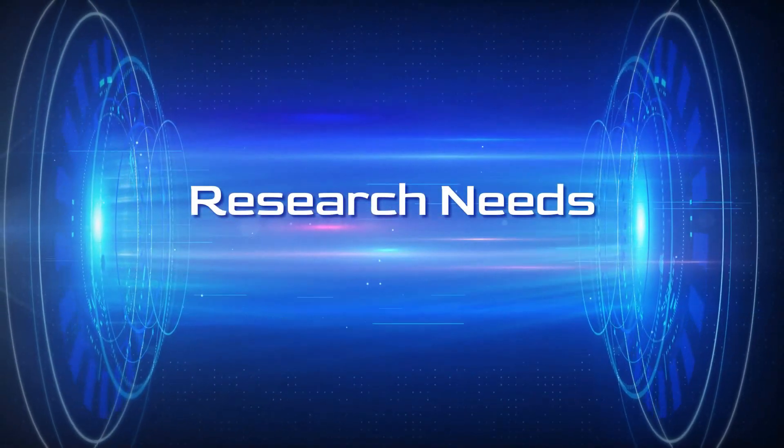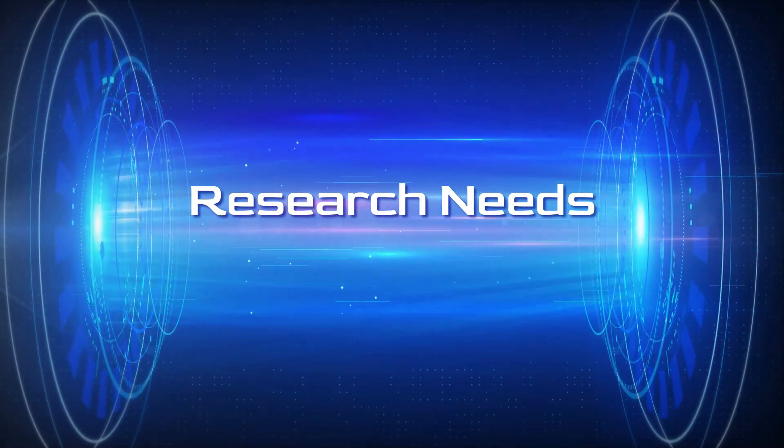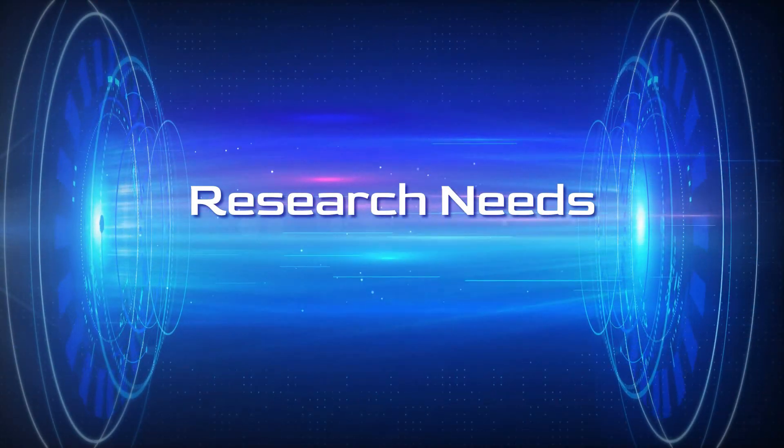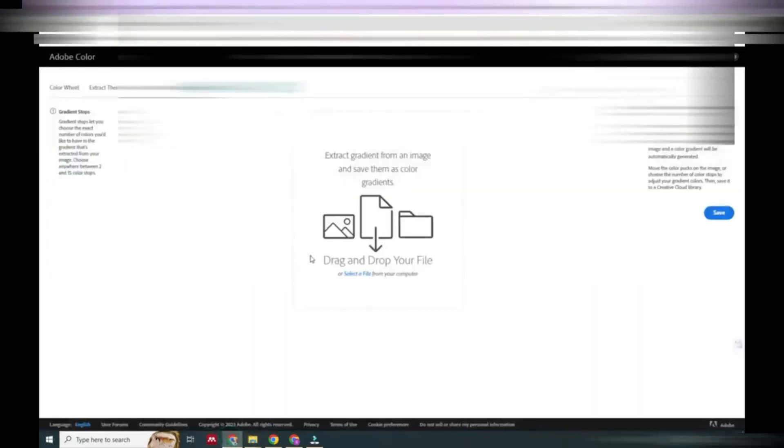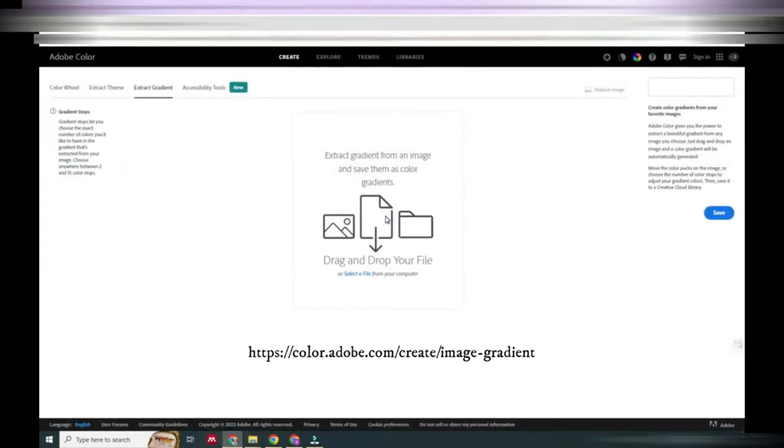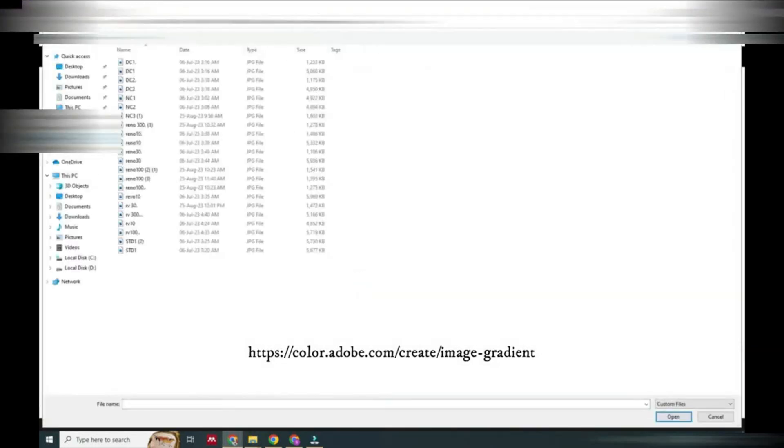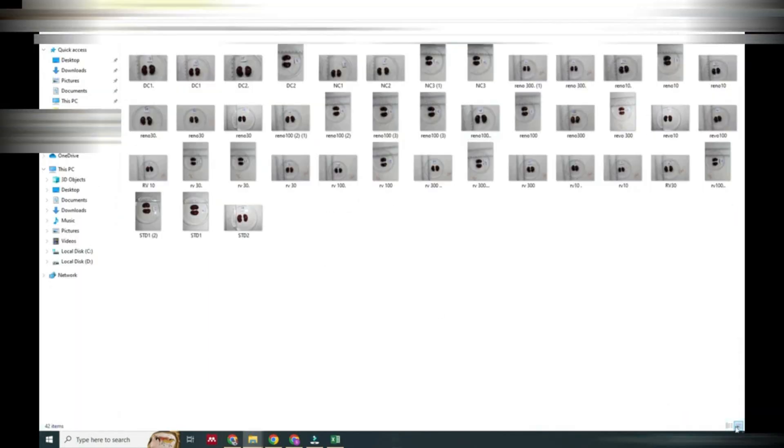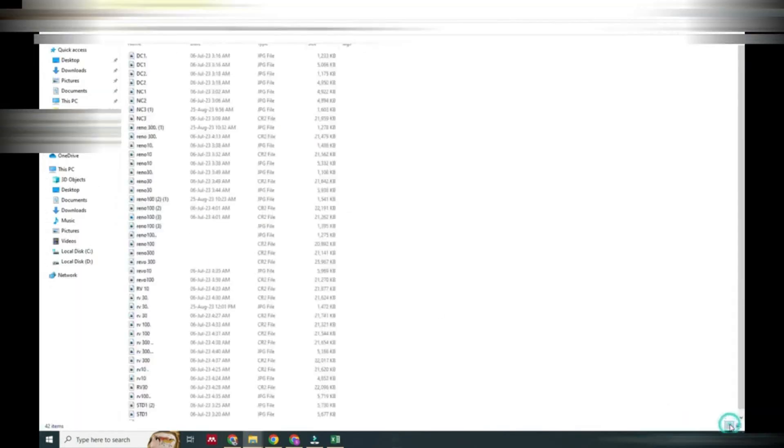Hello friends, welcome to Research Needs. In this video we will see how to use RGB values to analyze pathological changes in animal organs. We will select an image like this - here we have several kidney organ images.